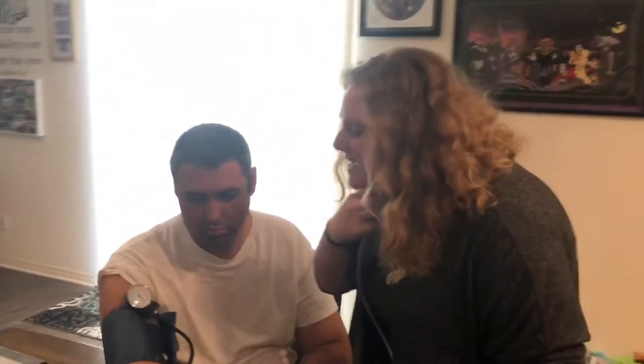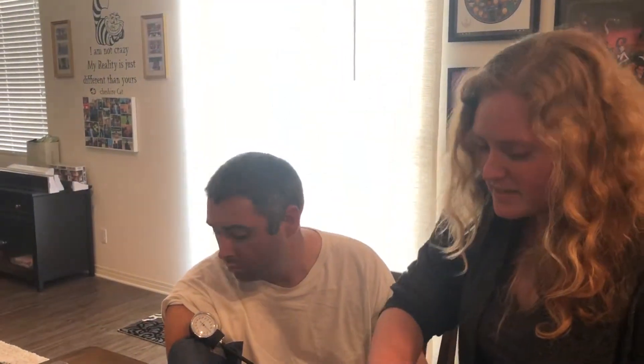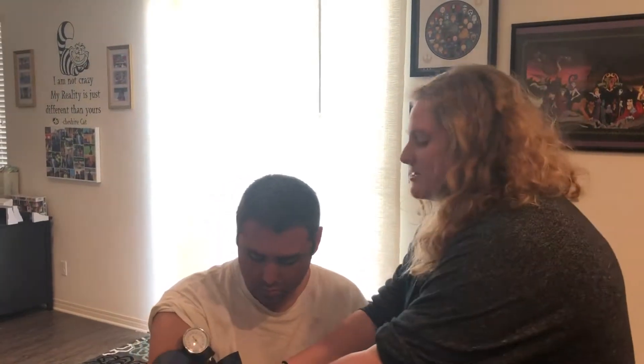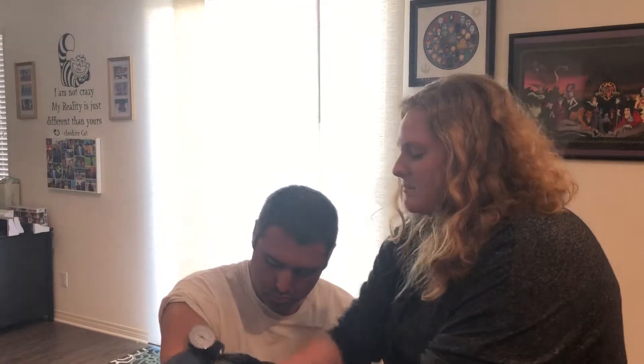The blood pressure that I got was 114 over 69. What you first hear is the systolic blood pressure, which is the first part of the heartbeat that you hear. And then the last part is the diastolic blood pressure, which is the last that you hear from the heart beating.